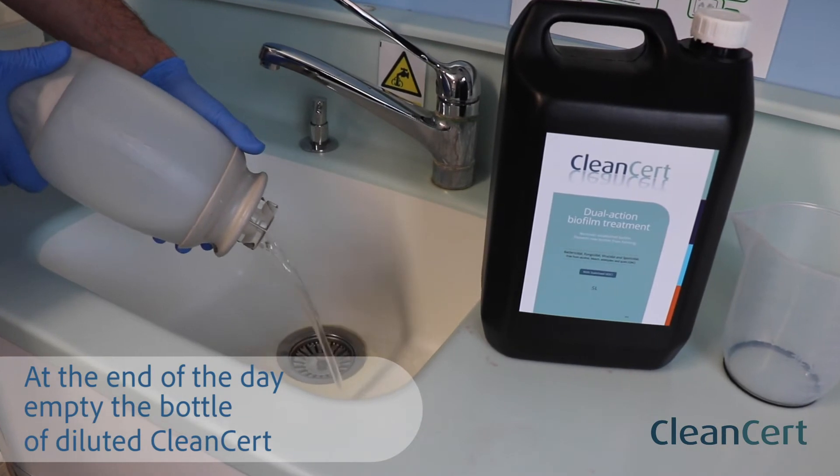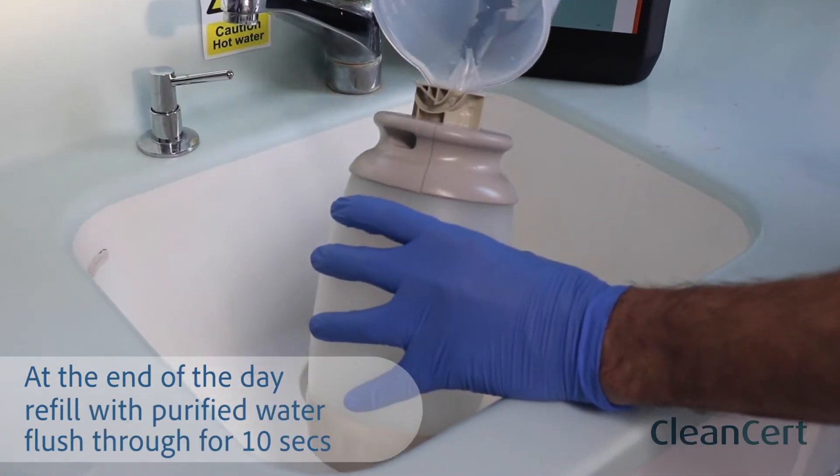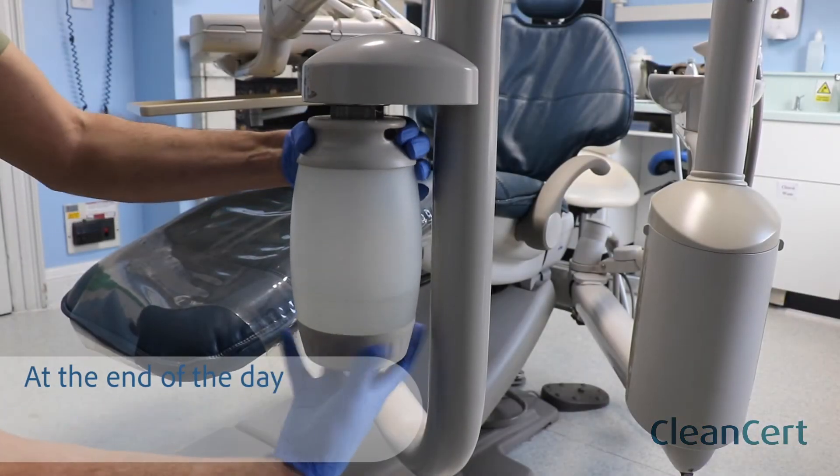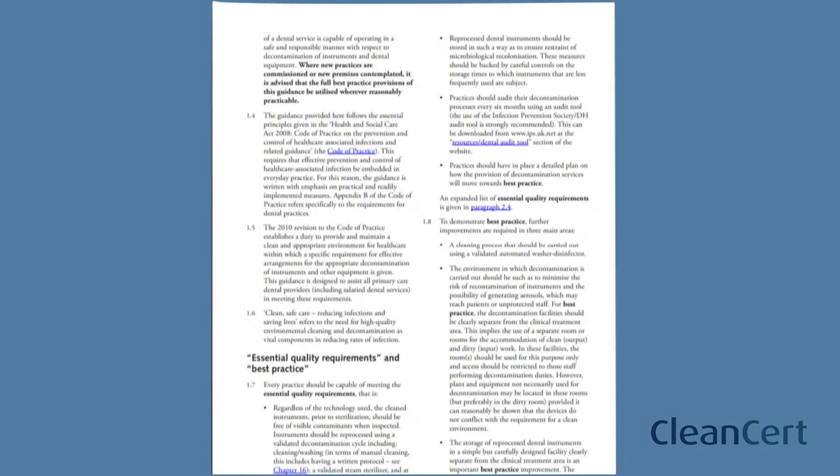Empty your water bottle of any remaining diluted CleanCert, refill with purified water and flush through all water lines for 10 seconds. Now remove your water bottle and allow it to dry inverted.